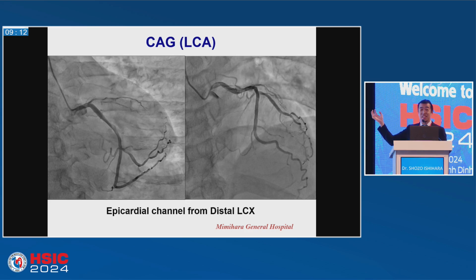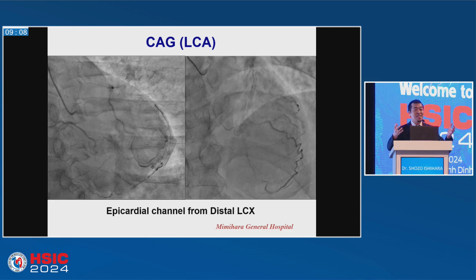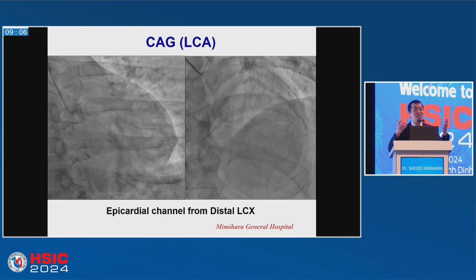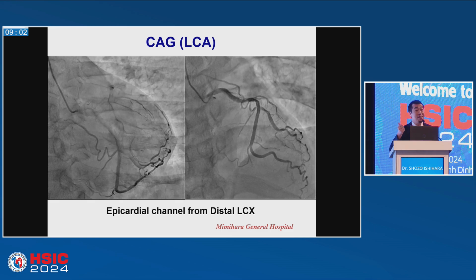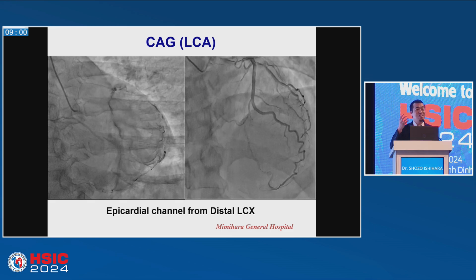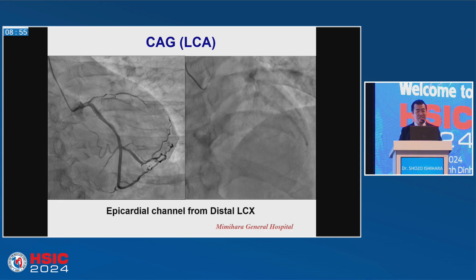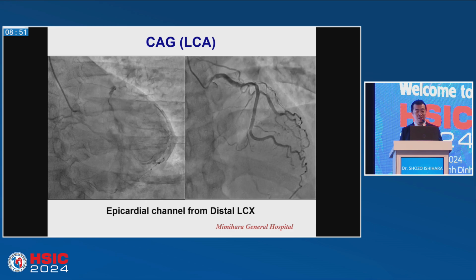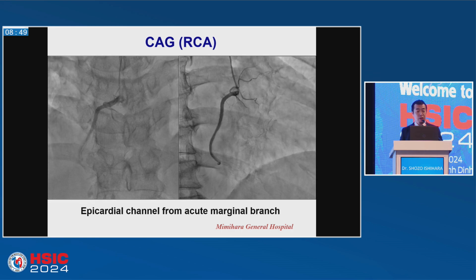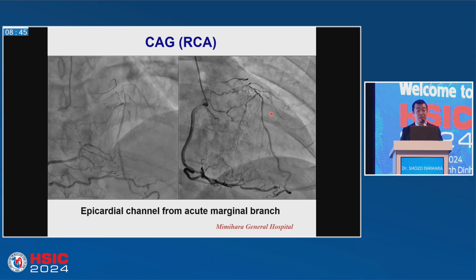But this case was not in our hospital, but another hospital. For young doctors who want to do and learn CTO, I visit hospitals in Japan and teach. So the young doctor tried to do this CTO lesion by himself. This is the LAD CTO like this. And we can also see good collateral from the RCA.